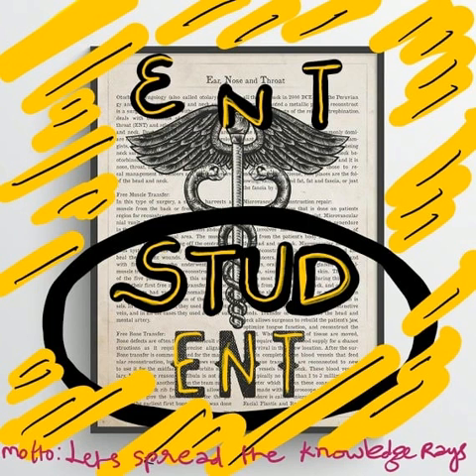Using a large cutting burr, the boundaries of McEwen's triangle are marked by 3 cuts. It is the landmark for opening the antrum, which is 1.25 to 2 cm deep to the lateral surface of the mastoid bone.